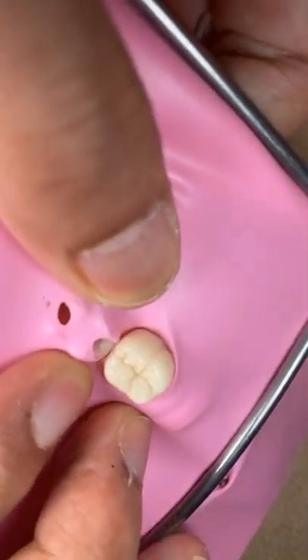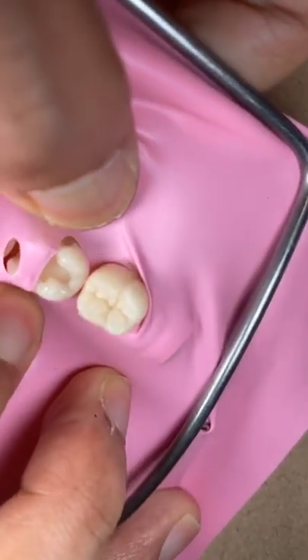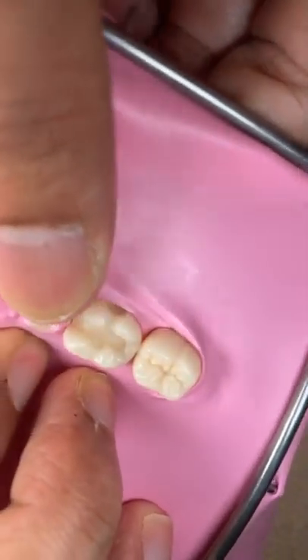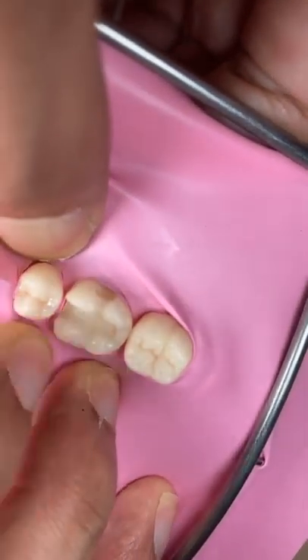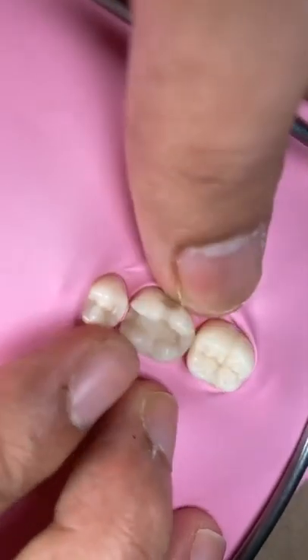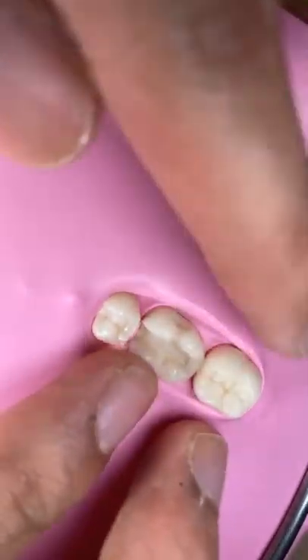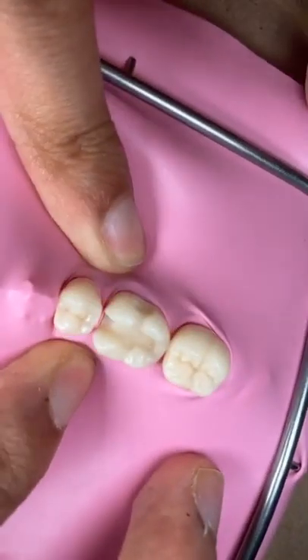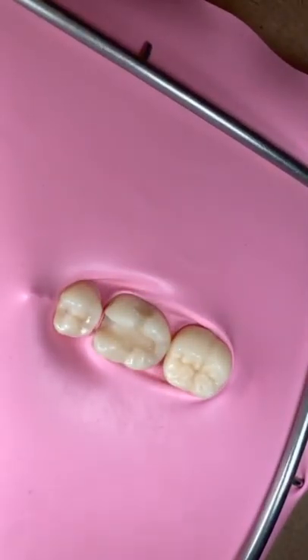Just because it's only a mannequin, only a phantom, it's okay to not use forceps, yeah. It's okay to skip the clamp. It will stay there forever. See?